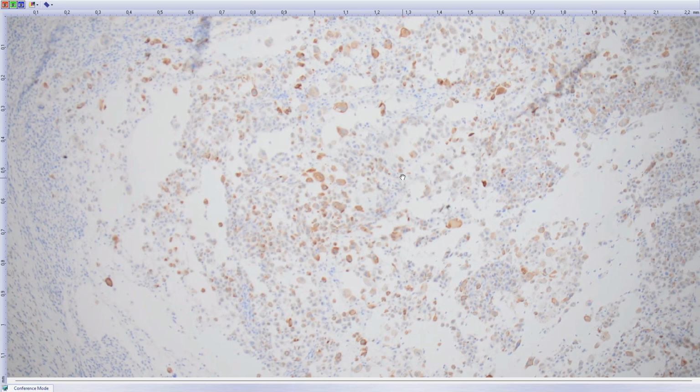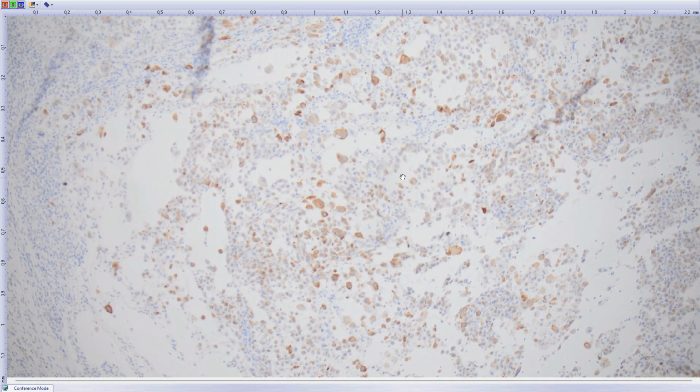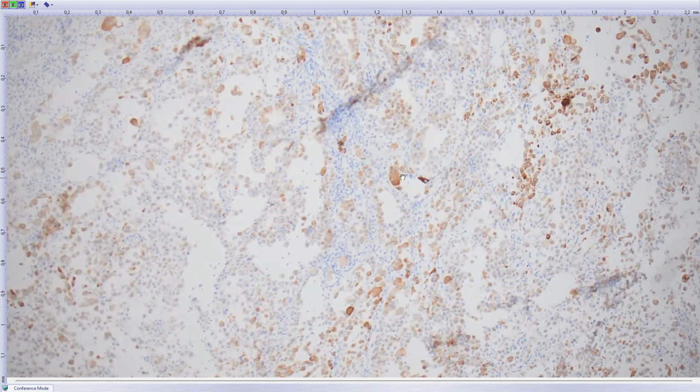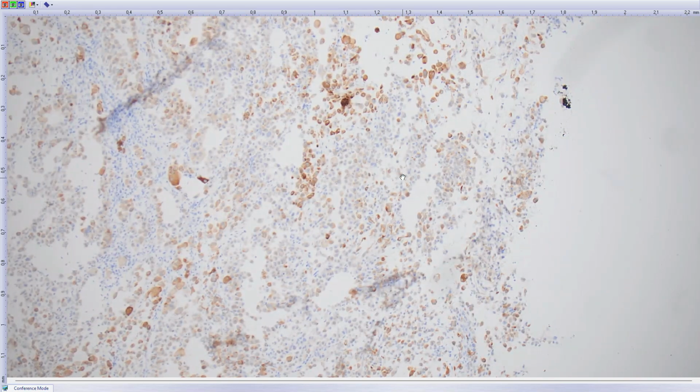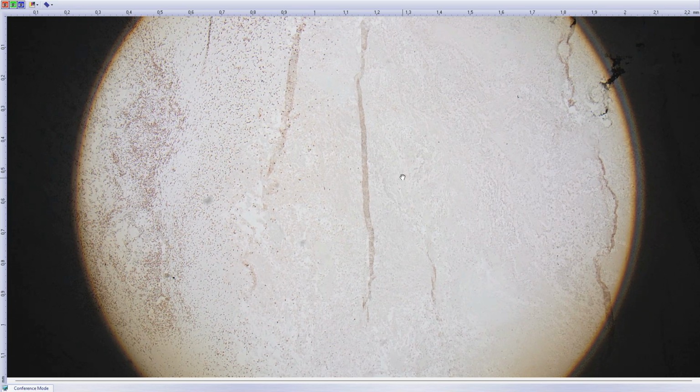The clinician called later to tell me that the patient has a suspected metastatic disease to adrenals, and there is a suspicious focus also in her lungs. So again, broad immunopanel was done with TTF1 and all the relatively site-specific markers. Everything was negative. Eventually, because of the epithelioid and rhabdoid morphology, one marker was added.